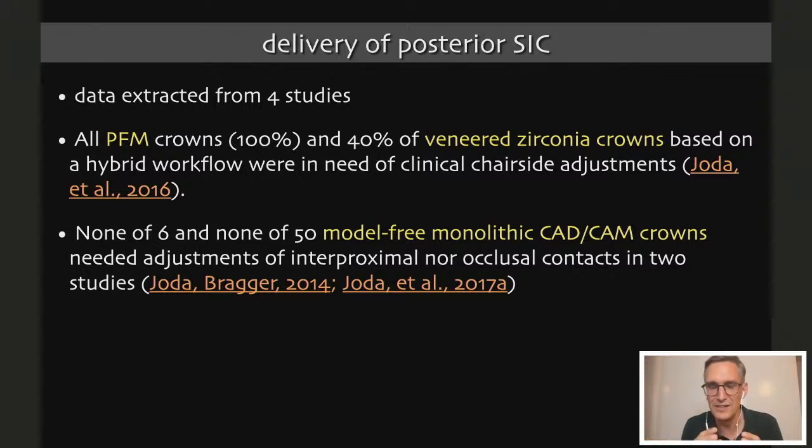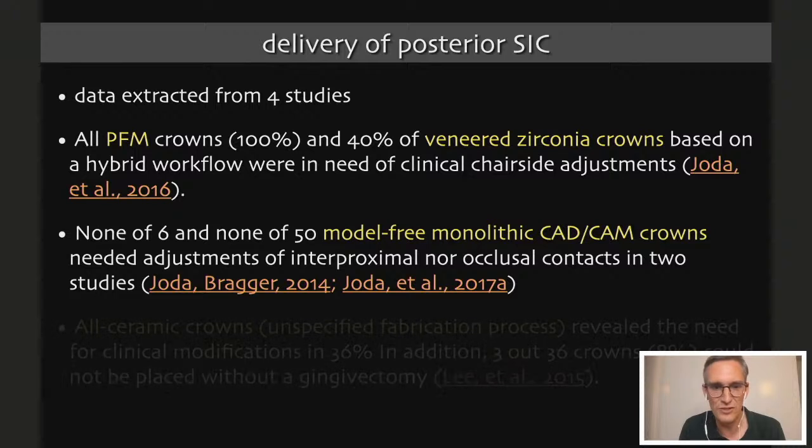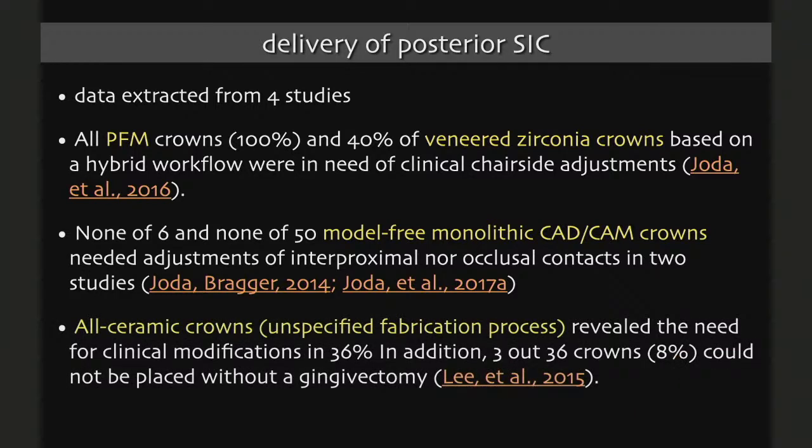It was not done in the dental lab, but by the implant manufacturer, and therefore you achieve a high industrial quality, which somehow explains these good outcomes. In my personal experience, sometimes, as in a conventional workflow, I need to adjust those crowns.